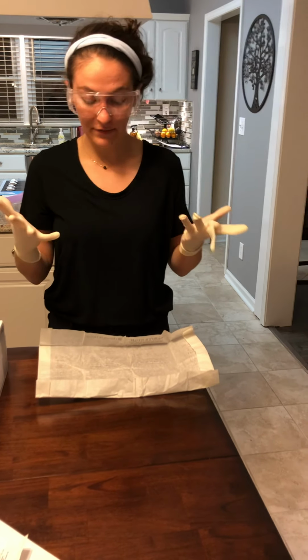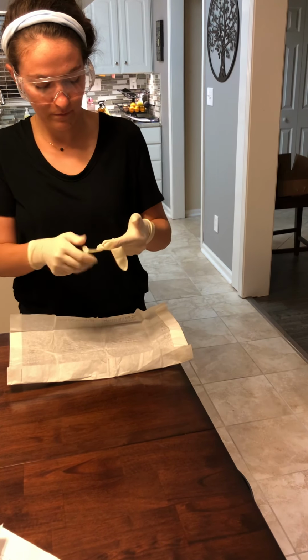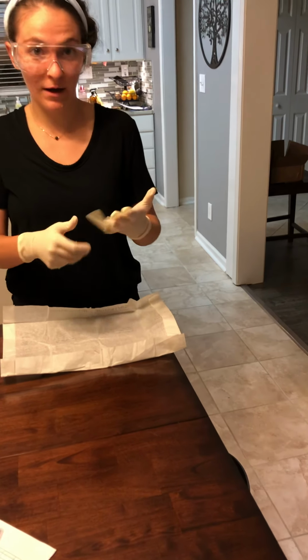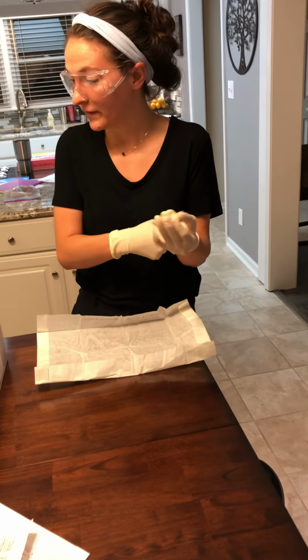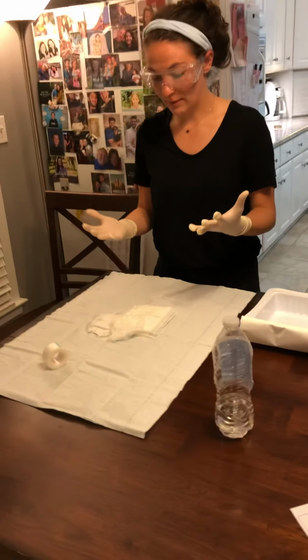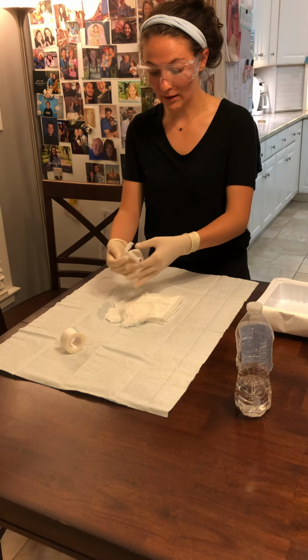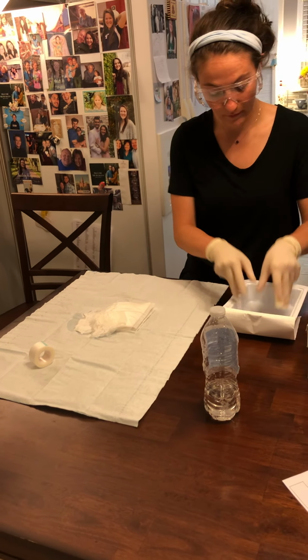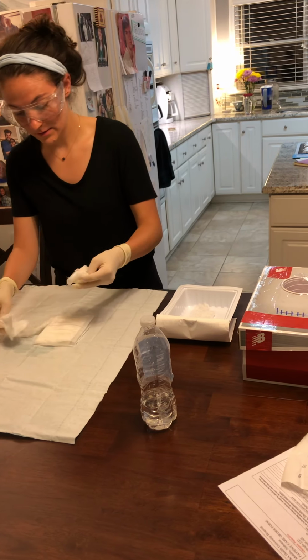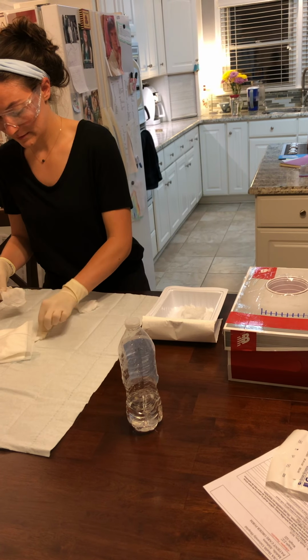Okay, now that my gloves are on, I'm going to go ahead and fix this problem. I think I got a size too small at the bookstore, but that's okay. Okay, now that my sterile gloves are on, I'm going to go ahead and prepare my sterile field. I'm going to go ahead and put 6 of these in here, except for this.